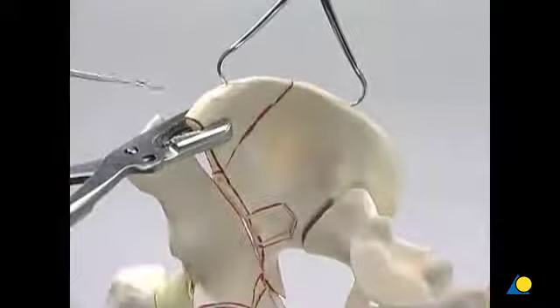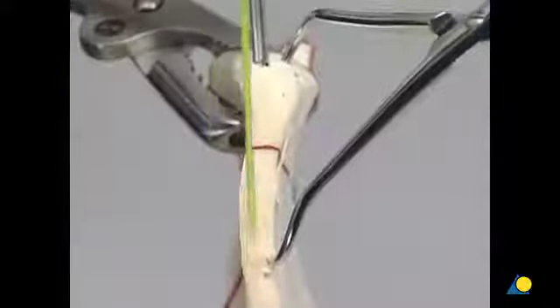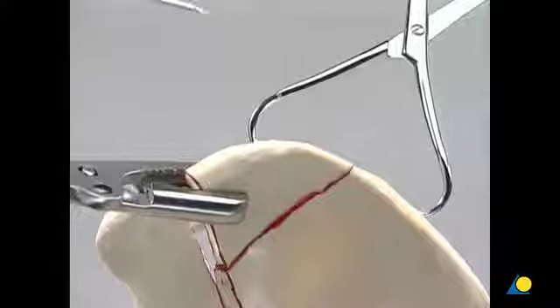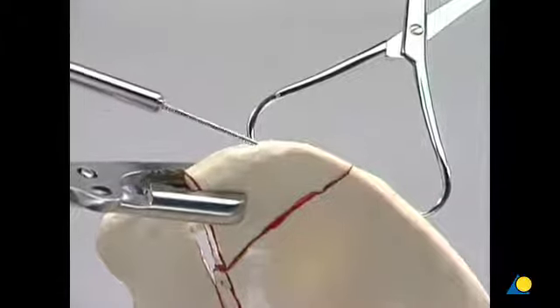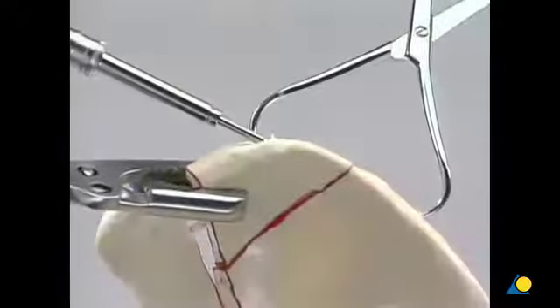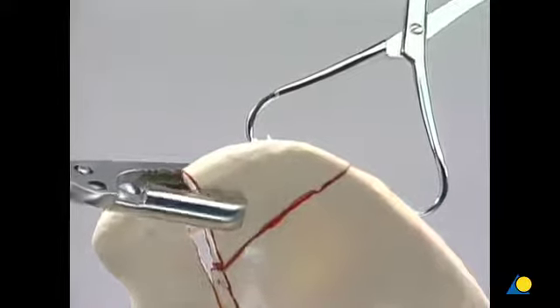A hole for a lag screw is prepared in the usual manner, close to the peripheral border of the iliac crest. To compress the fracture line, a 3.5 mm cortex screw is inserted. The Farabeuf clamp is removed.